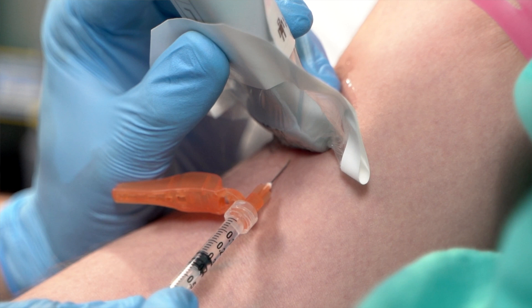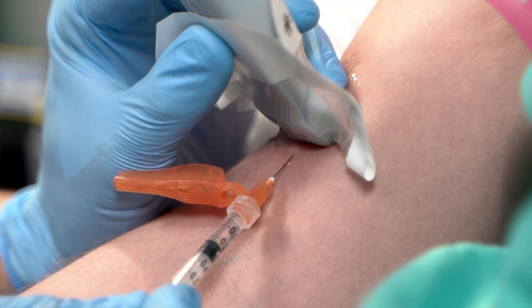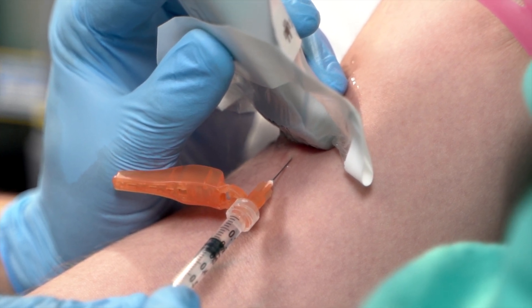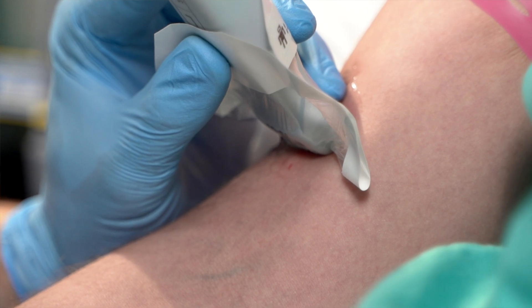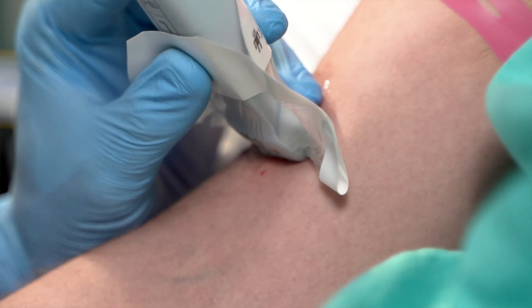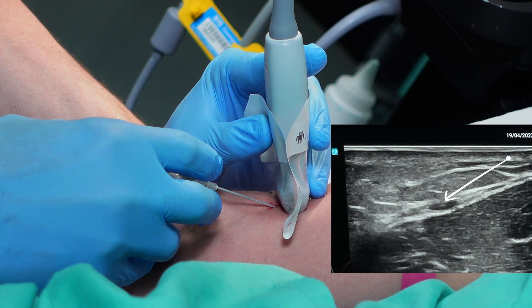Your confidence with local anaesthetic will increase the more you use it. Use one percent lidocaine and the smallest needle you can find. Introduce your needle just into the dermis to perform an intradermal injection and raise a small wheal, which should blanch to confirm you're in the right place. Then insert your cannula through the injection site. Keep your probe in the out-of-plane short axis view and introduce your cannula into the middle of the probe, looking for the needle coming into view and tenting the vessel. You can calculate the angle of insertion fairly accurately based on your distance from the probe and the depth of the vessel — for example, if you insert the needle one centimetre from the probe's centre and the vein is one centimetre deep, stay in the midline and advance at 45 degrees to the skin.